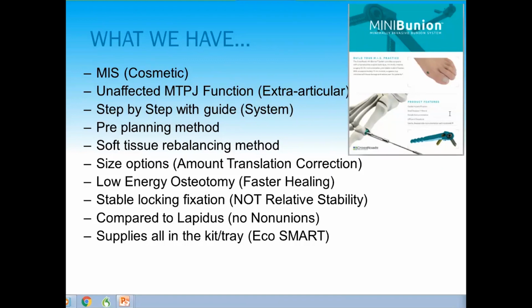If you add those two together, the medial wall of the bone or cortex is 2 millimeters. Add the 3.5 millimeters, then you're translating 5.5 millimeters total translation of the capital fragment. So that's how you can figure how much translation you're getting there.